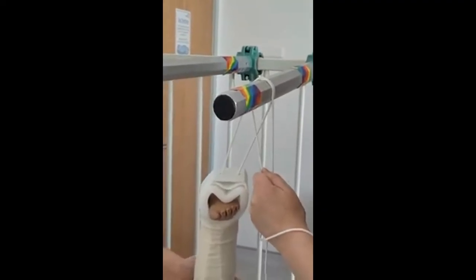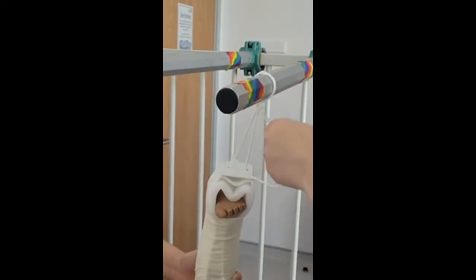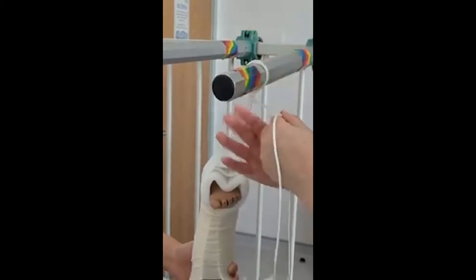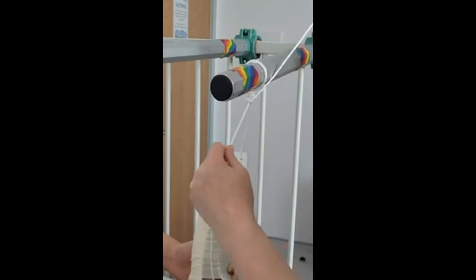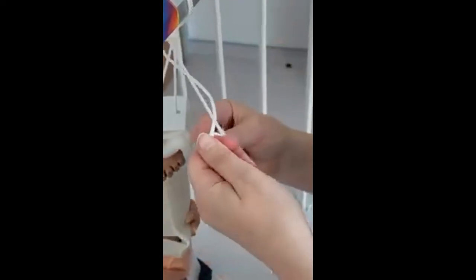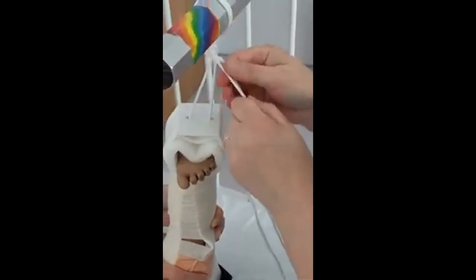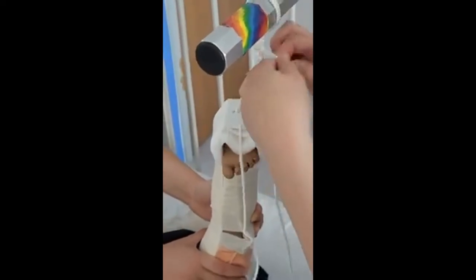We need to make sure that the child's bottom is just off the edge of the bed so that it's not rubbing on the bed. Cross the strings over and round, then tie the knot which is a clove hitch: going once, wrap round, round again, then bring the end back through the middle hole and pull it up. That's a nice tight knot but it cannot slip. And if you like an extra bit of safety, go round and round again and take it through the hole and pull — you've got a nice strong knot that's not going anywhere. Then do one more single knot just to hold those strings in.